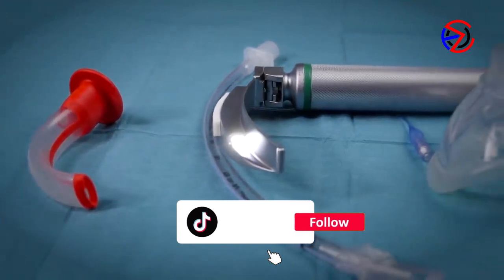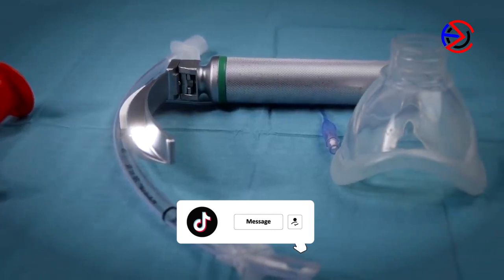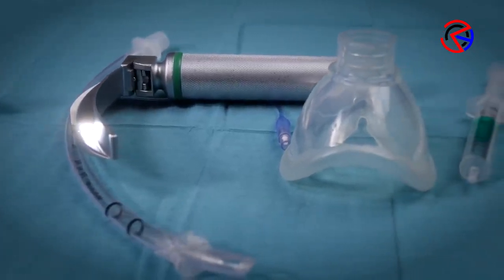Endotracheal intubation. Endotracheal intubation is an important part of airway management.